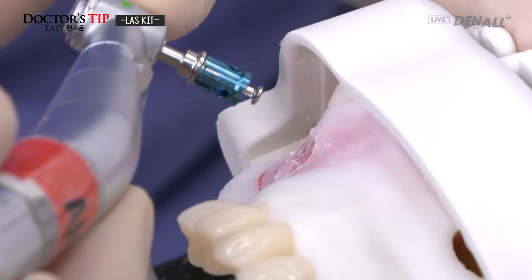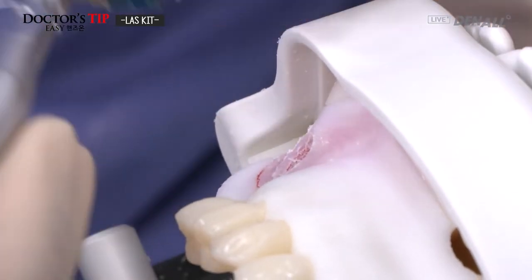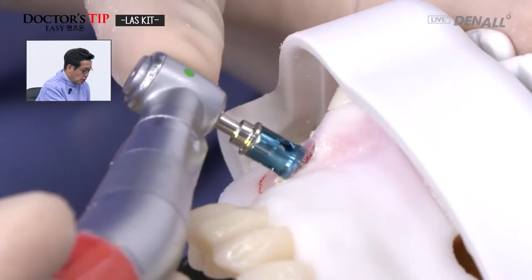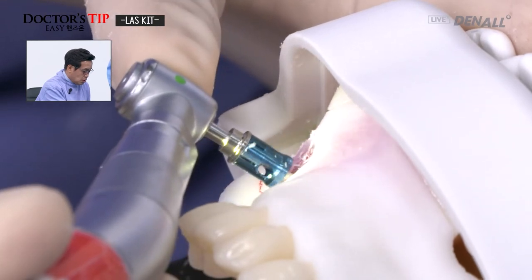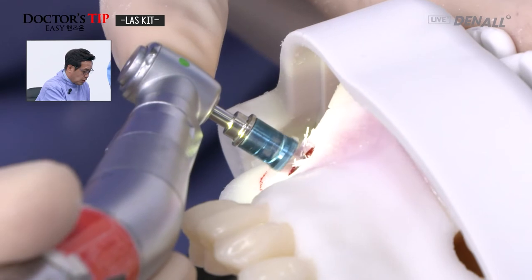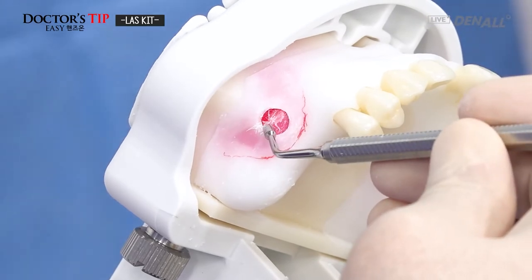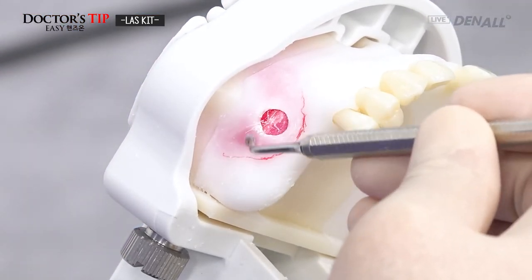So the sharp area, we push it like this, and the dome-shaped part can protect the sinus membrane. So we round it so that the sharp part can be removed. So the thin remaining part with the sidewall drill has been all removed.